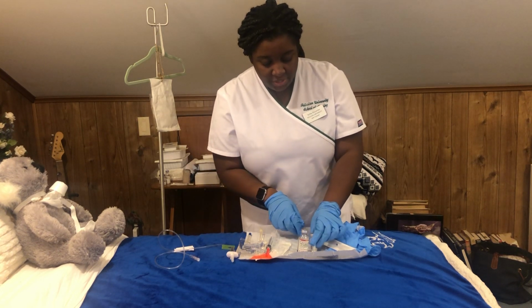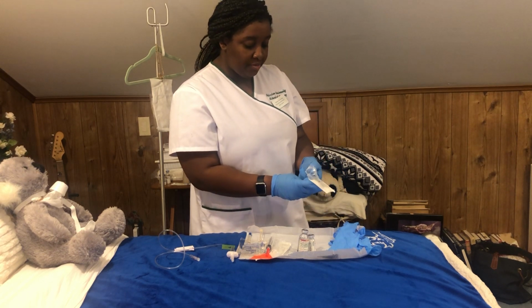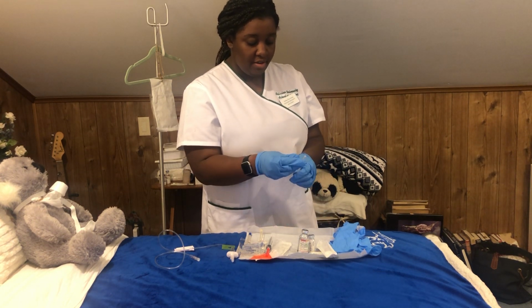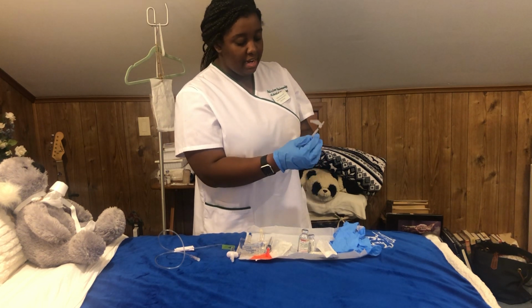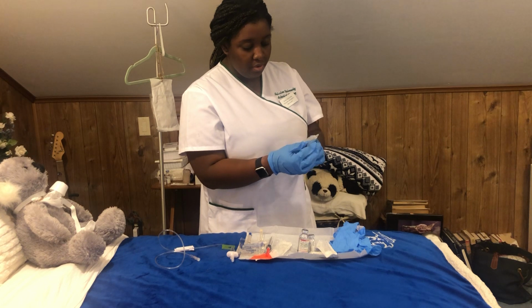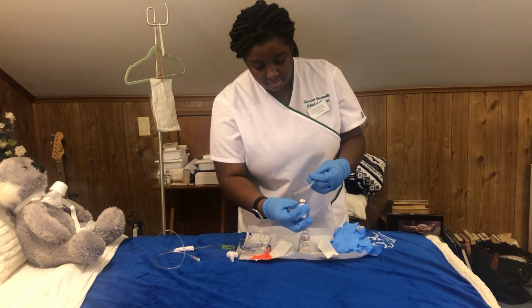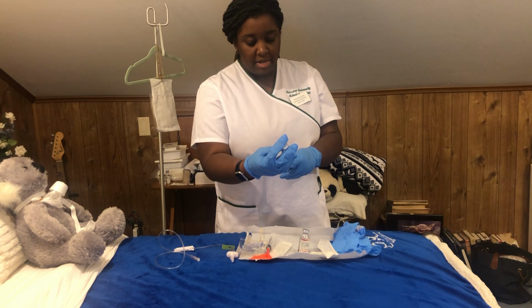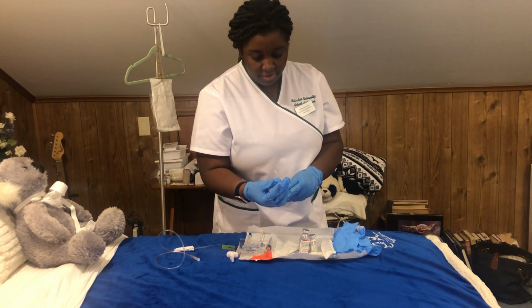Okay, and so I will then take up my second syringe and withdraw according to my MAR, my medication guide. I will take 1 ml of the reconstituted medication. So before I do that, I'm taking out 1 ml of air to insert into the bottle. I'm doing so while it's laying down, and then I will flip the bottle, the vial, and withdraw 1 ml of the medication. Okay, so I'm just going to recap the medication briefly.